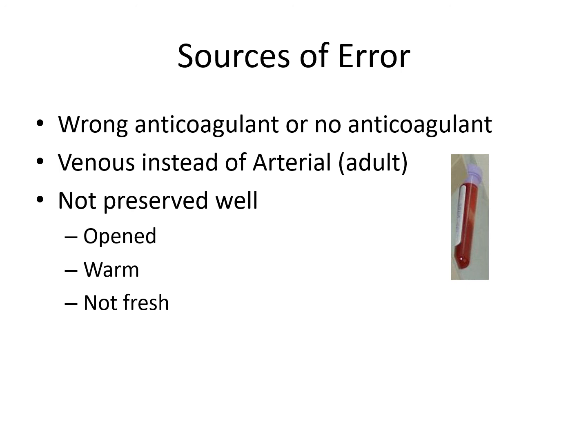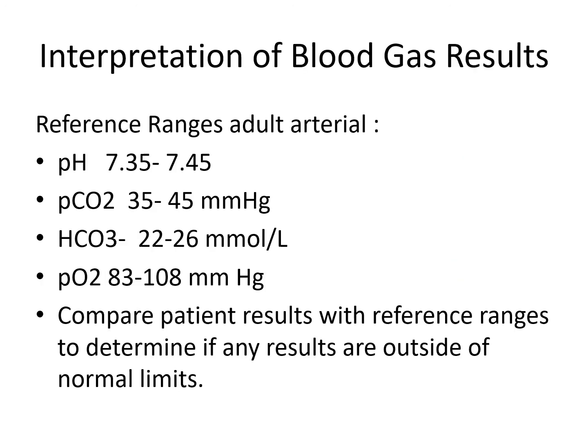Proper preservation of the specimen is very important. We should make sure that it is not opened because oxygen and carbon dioxide may be released in the process. And if we do not use ice to preserve the specimen, and if it has been drawn for a long time, it will become erroneous.